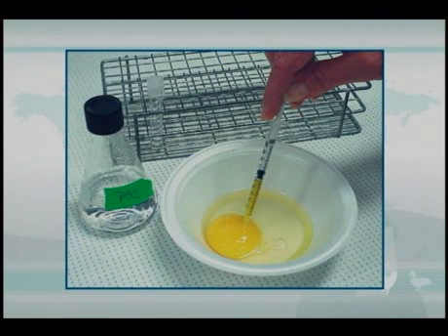Also, which we will demonstrate in the lab, the antibody in yolk often correlates fairly well with the circulating antibody in serum. And so for surveillance purposes, yolk antibody testing can be used to monitor certain types of production flocks for avian influenza. Breeders as well as table egg layers can be easily sampled in this manner. The advantage of using yolk serology is that you don't have to be concerned with biosecurity going on the farm to collect these samples. These samples can all be collected at processing plants very easily.